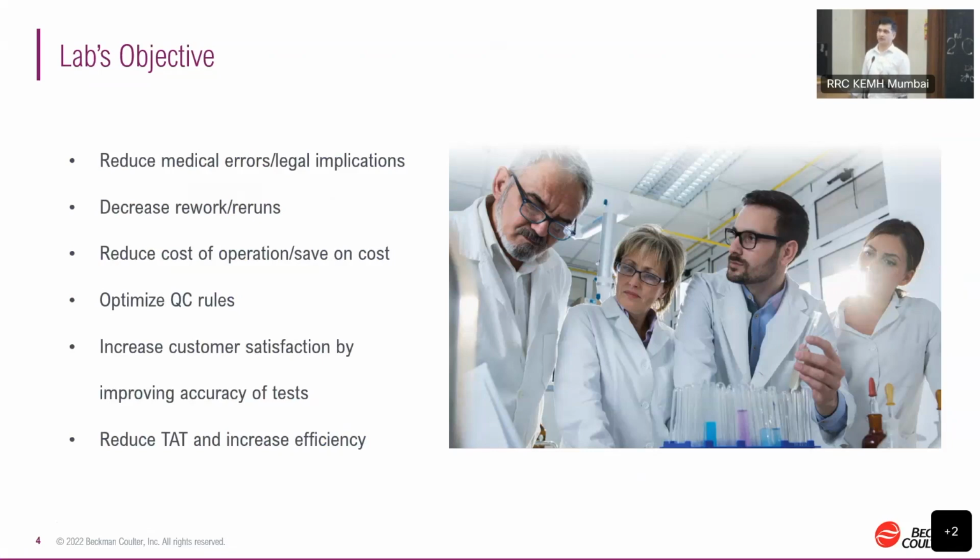Looking at QC in day-to-day practice can be cumbersome if you try to incorporate all the rules, like monitoring the trend, monitoring the bias, monitoring precision, etc., for each and every analyte, and that too in each and every lab, right? So we'll see how we can simplify this with Six Sigma.